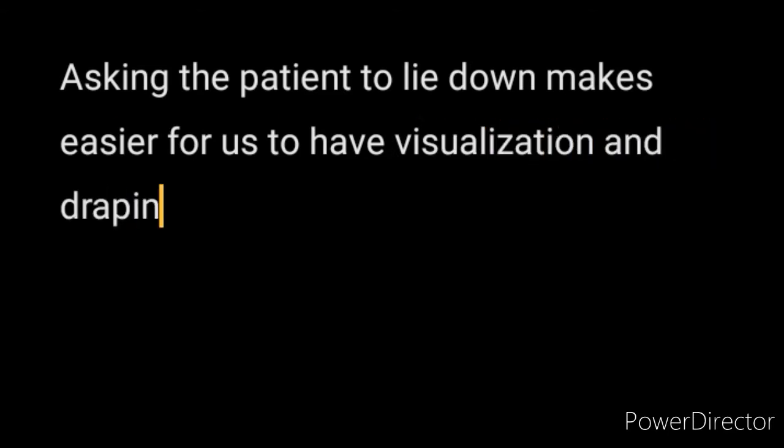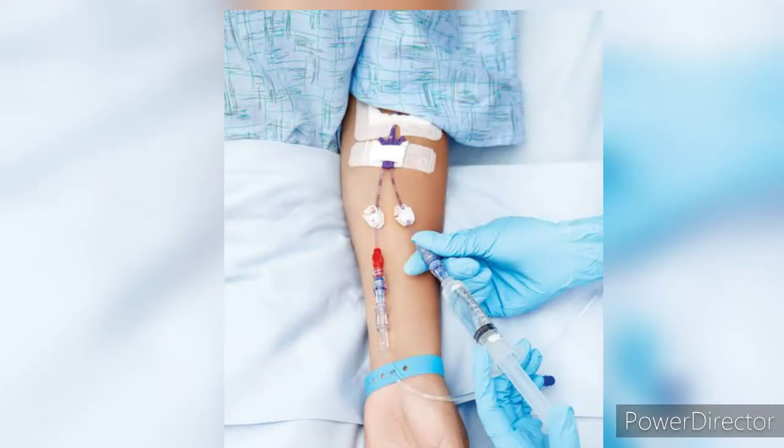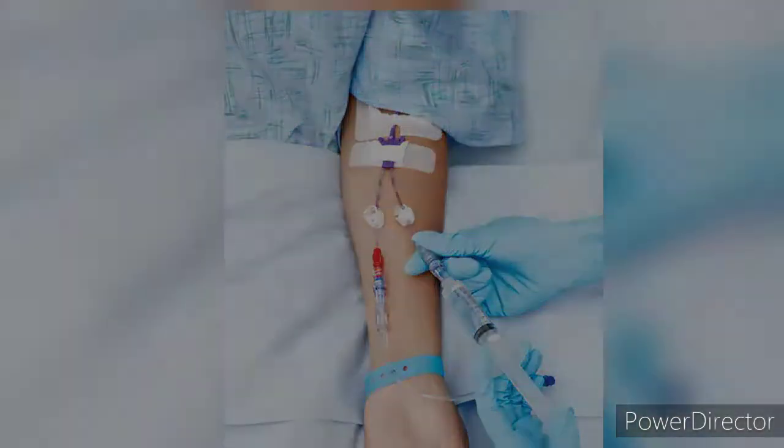Asking the patient to lie down makes it easier for us to have visualization. Draping the client provides them their privacy. Ma'am, I will start an IV infusion to restore the blood loss, and I will mix a medication to your IV fluid that will help your uterus to contract. It helps restore blood loss and treat shock. It also keeps the uterus well contracted and stop the bleeding.